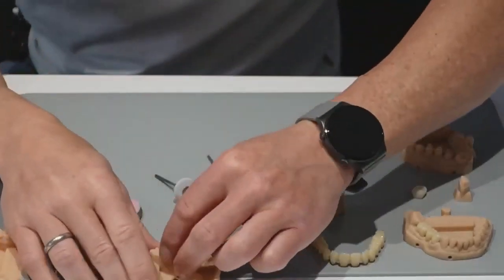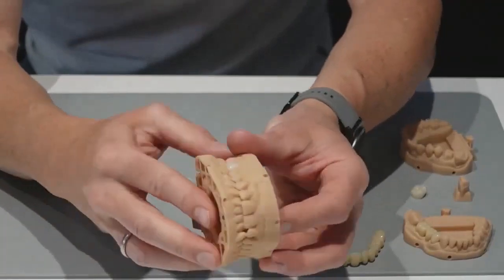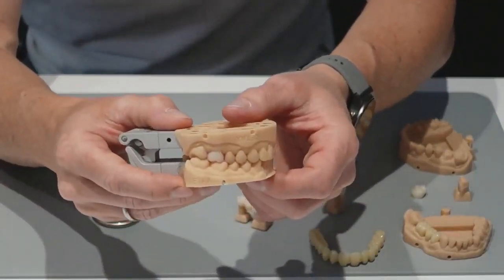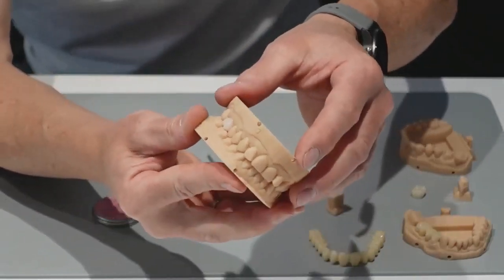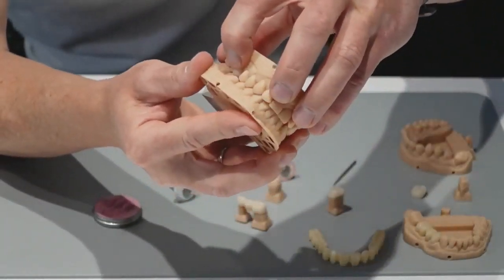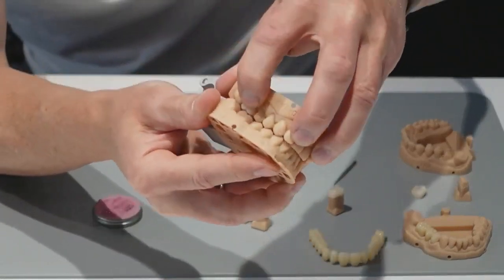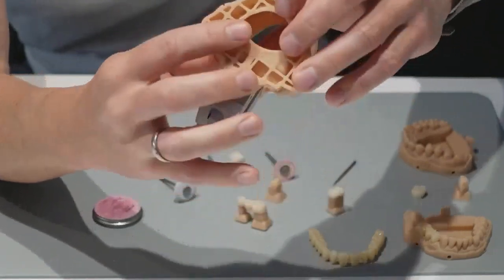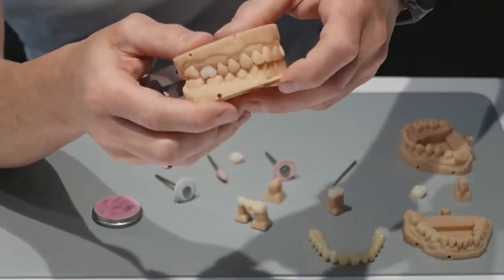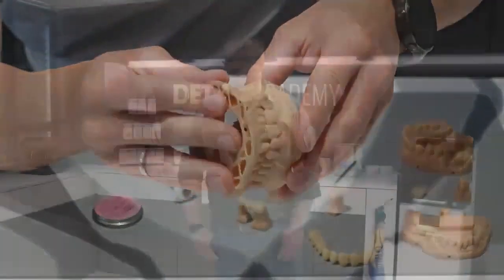And now we can check the occlusion with the articulator. This is our case, the original case from the design process. And here you can move or make a side shift with the same contact you have here, like in the software. Also, you are done very fast. Marcus, thank you.